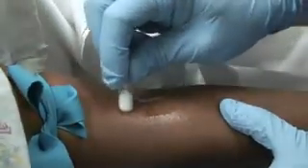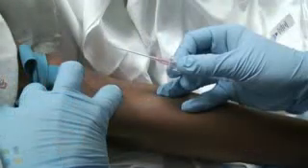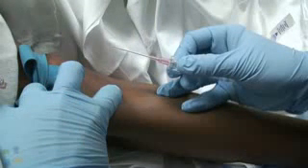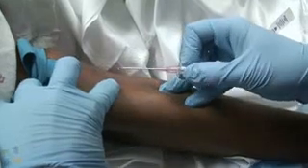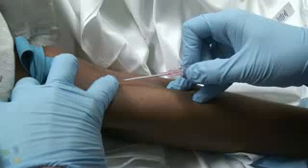Once you have found an appropriate site, clean the area with an antiseptic swab. Stabilize the vein with your thumb and forefinger, as veins have a tendency to roll away from the approaching needle. Take the catheter with your dominant hand between your thumb and forefinger. Make sure the bevel is pointed up.